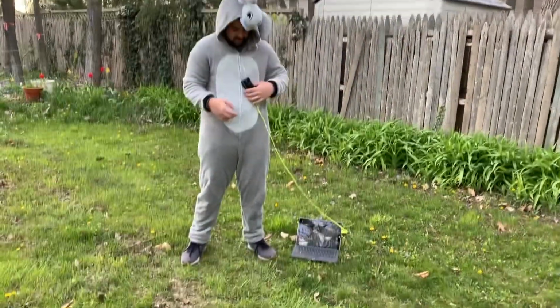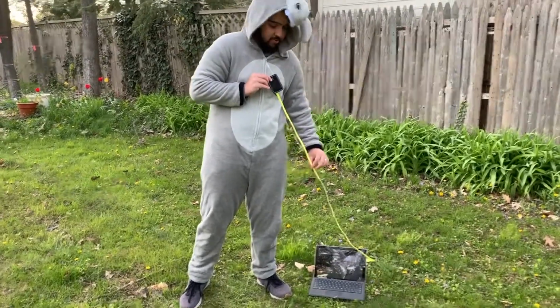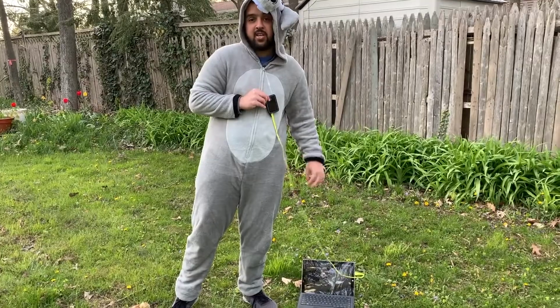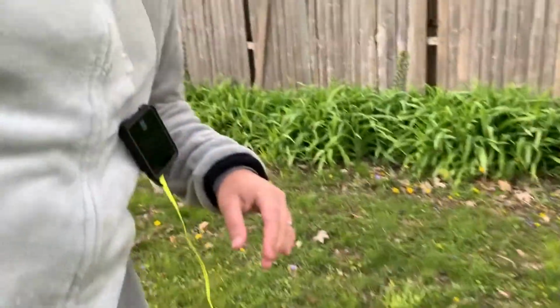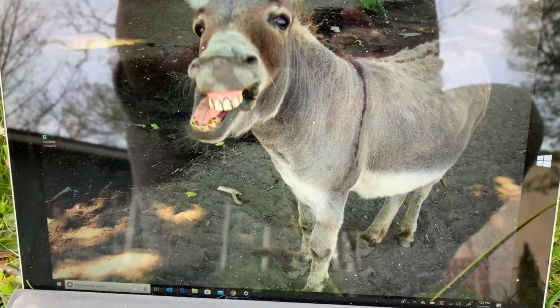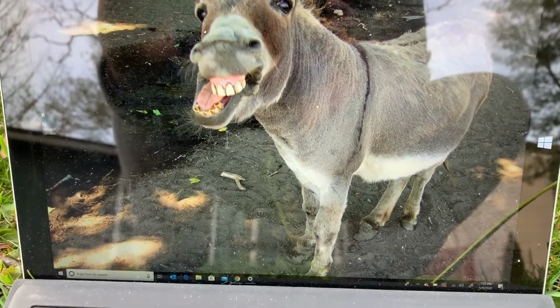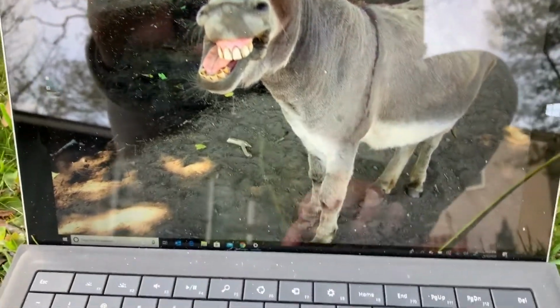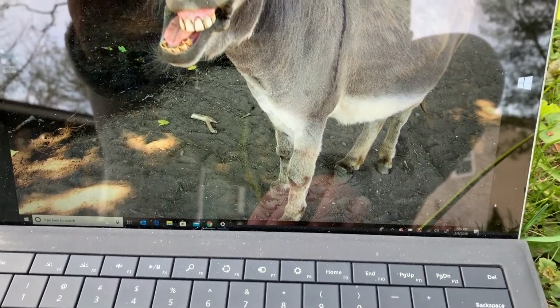Next, I want to download my insulin pump. As you can see, I have my insulin pump right over here connected to my USB cable, which is then connected to my laptop. So I'm going to have you guys come join me up close, and I'll show you how I download. Most insulin pumps have their own software, and you have to actually go to the website and download it. So mine's already installed, and as you can see, it's on my desktop. Sometimes you have to go to a menu to actually access it. See right over there.